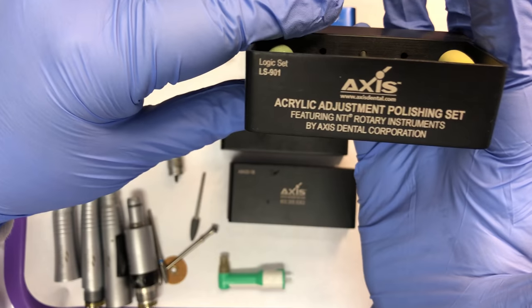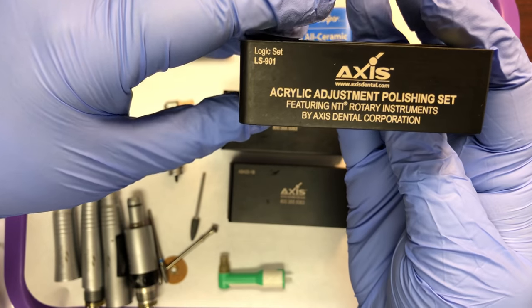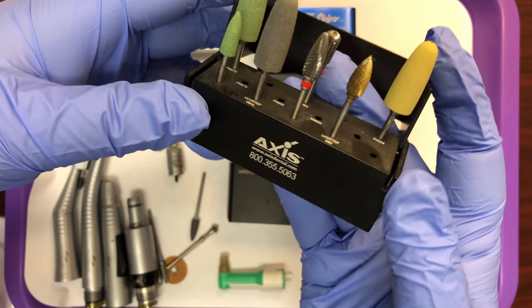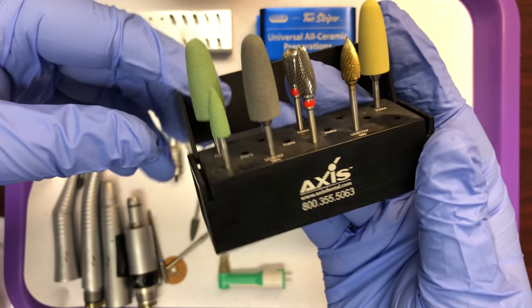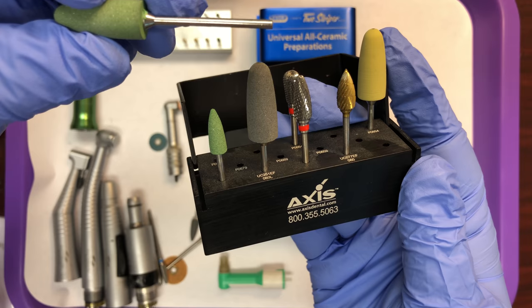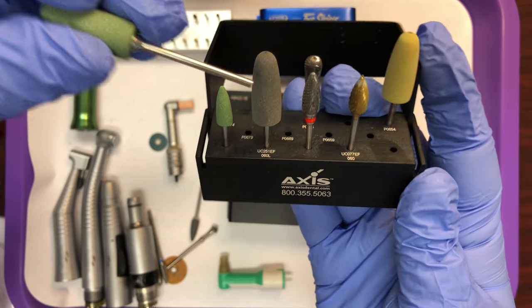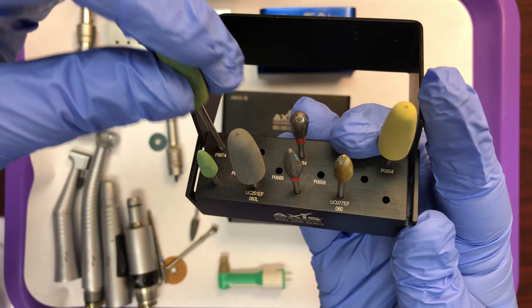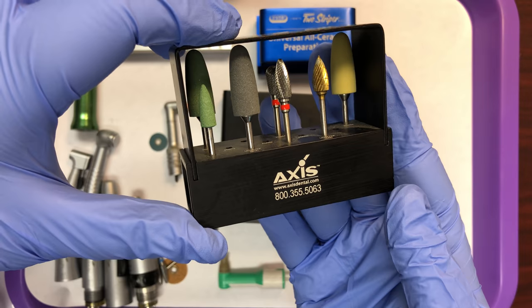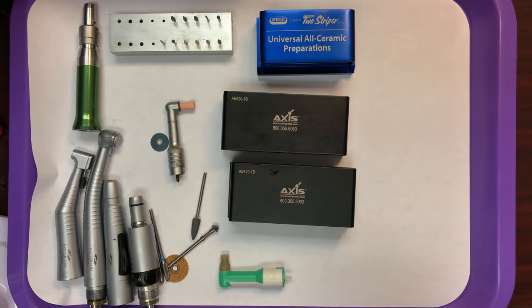Here's another example of a set. This one is specific for acrylic — polishing acrylic dentures, partials, retainers, anything made out of acrylic. Of course, due to the size of these burrs as well as the attachment style, these are used extra-orally as well. They go into the straight attachment of the low speed.